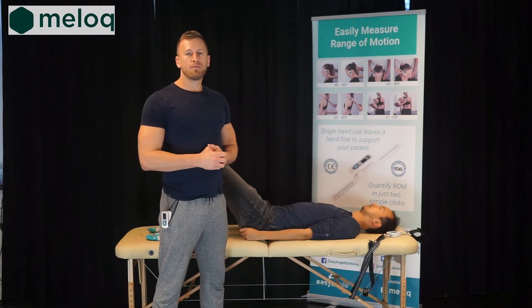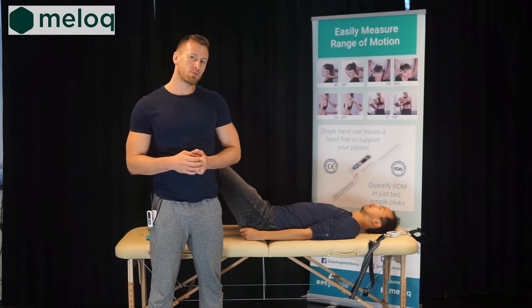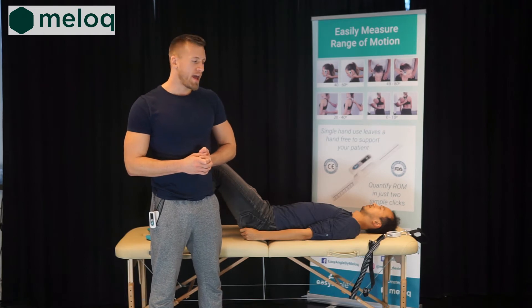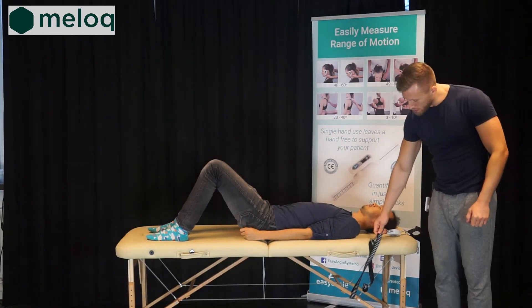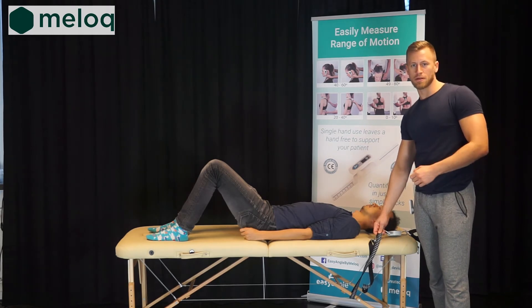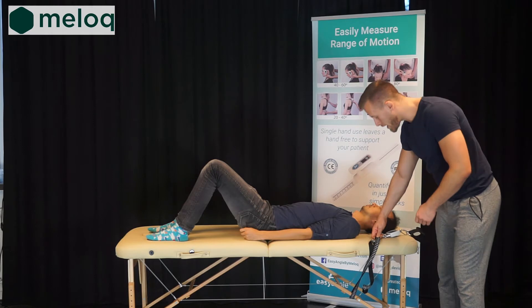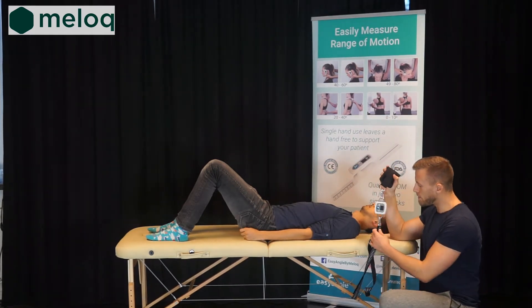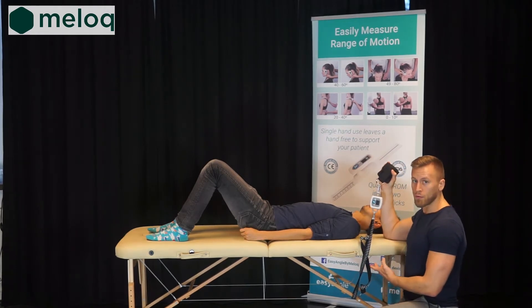After performing the assessment of range of motion using EasyAngle, we can proceed to measuring the muscle strength with EasyForce. For this purpose we will use a numbered strap, which is very useful if you want to repeat the measurement in the future — in this way you will know exactly where you are positioned. On the other side we will use the wrist attachment and attach it in the line of the trajectory of the movement.